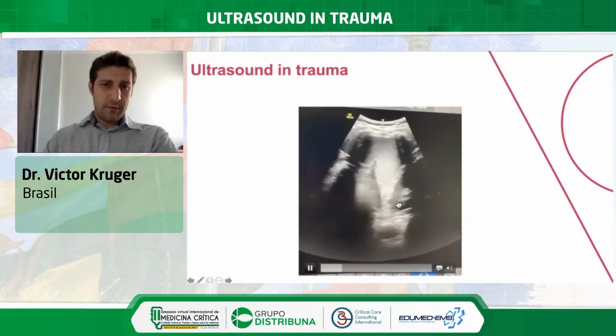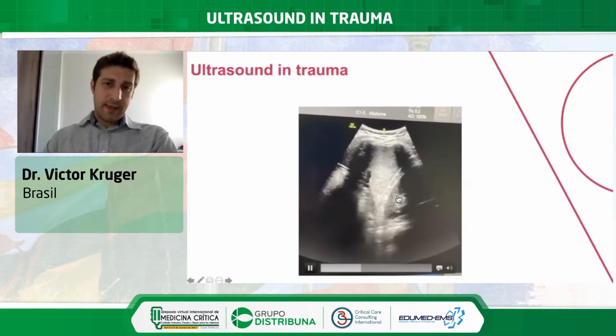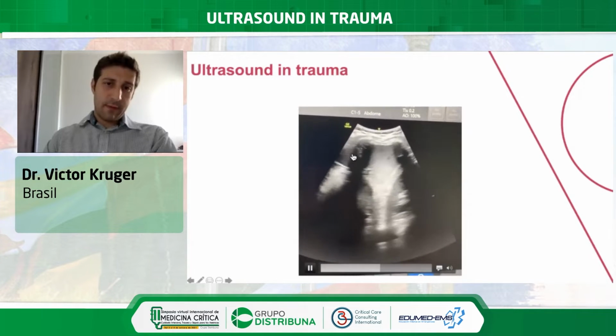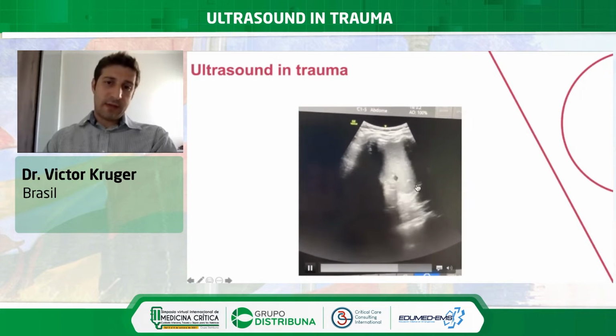In this video, you can see spleen, kidney, diaphragm here, lung, and the absence of the free fluid.